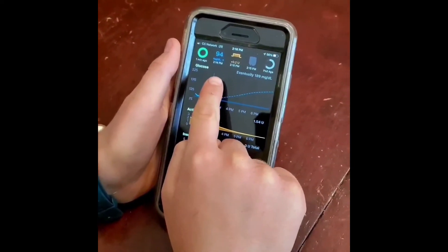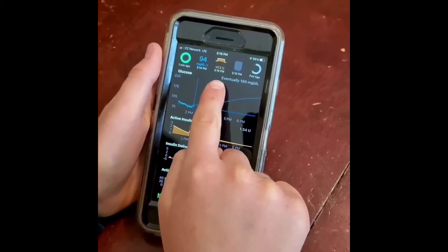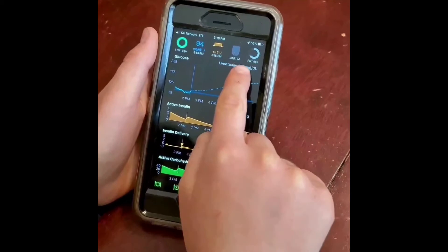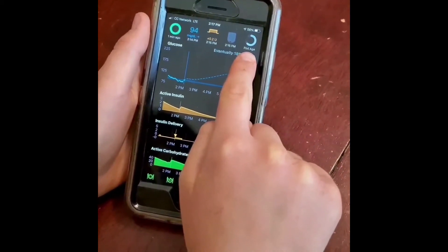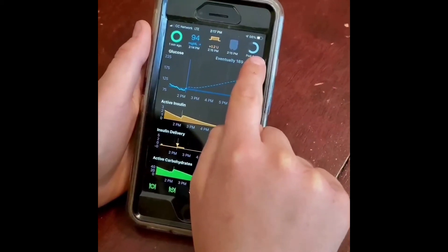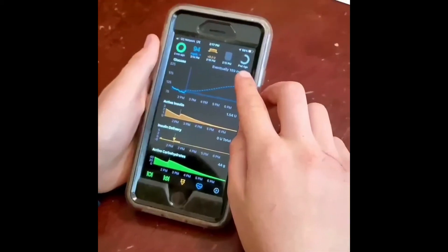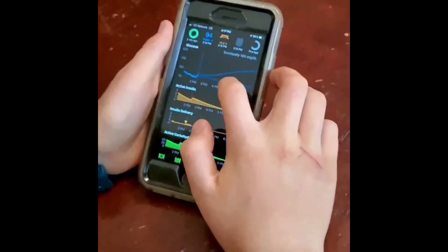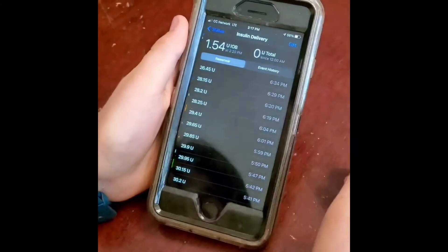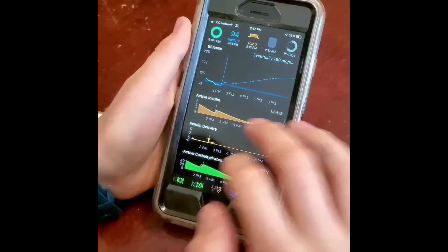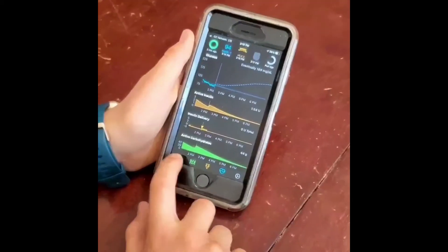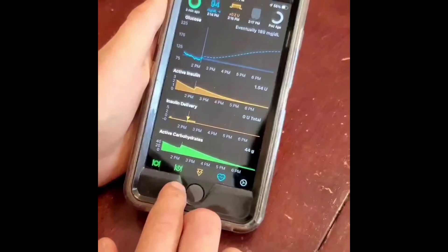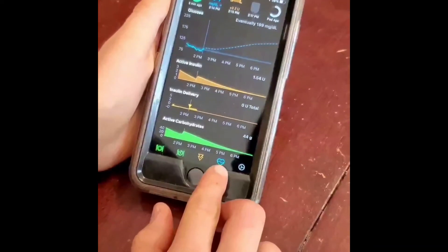This is the blood glucose value. This is the basal rate, which is relative to the scheduled basal rate. This is the pump reservoir status, and this is the battery status for Medtronics — but I have an Omnipod, so instead it's the Omnipod pod life. By tapping on the charts, you reveal more detail about glucose, active insulin, insulin delivery, and carbohydrates. The toolbar located at the bottom of the screen shows meals, pre-meal target, bolus, overrides, and settings.